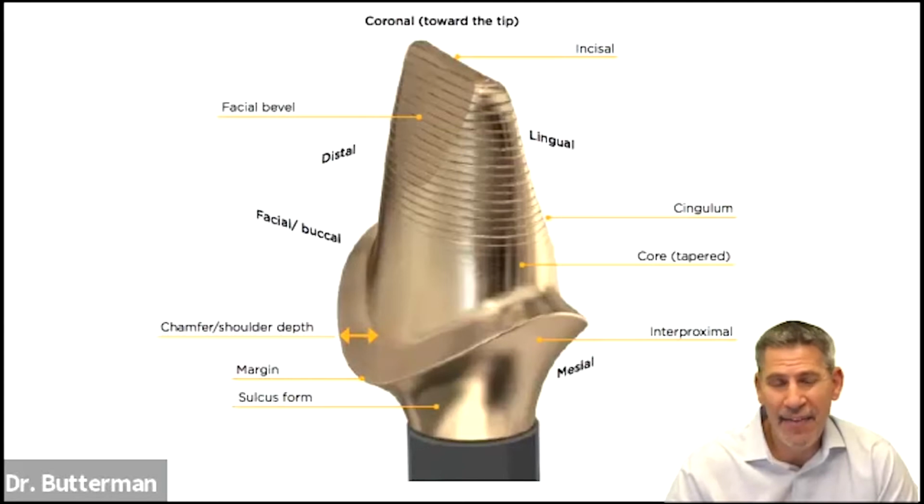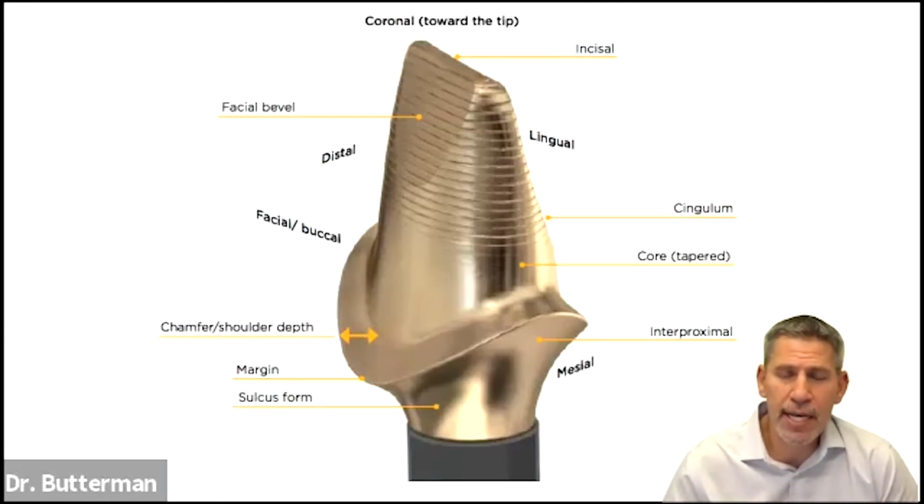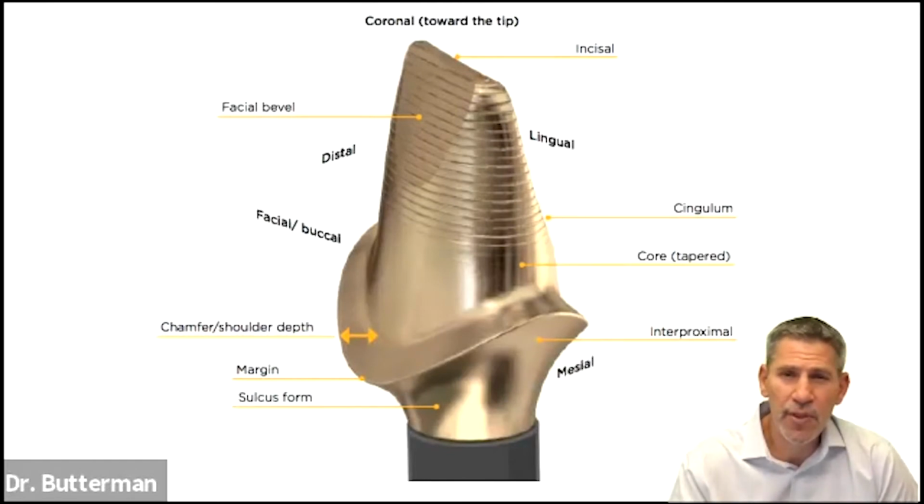And if I have to, it's the first thing I give away, because I just want to know, and I need it. I don't want a patient to say, well, I don't want to do a cone beam scan, I don't want to pay for that, let's just do your implant. Anytime you add a price to something, you have to talk to the patient about it, and I don't love talking to my patients about money in the first place. Once you do that, it gives the patient an opportunity to say, I don't want this and I want that. I want to be the one that decides. So if I need to, I don't charge for it. But great question.